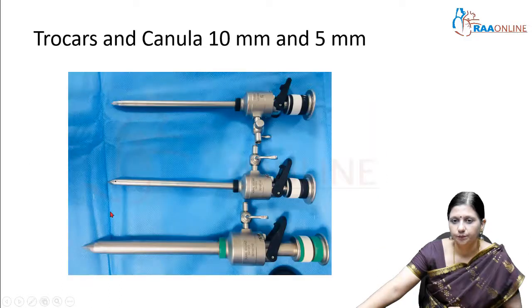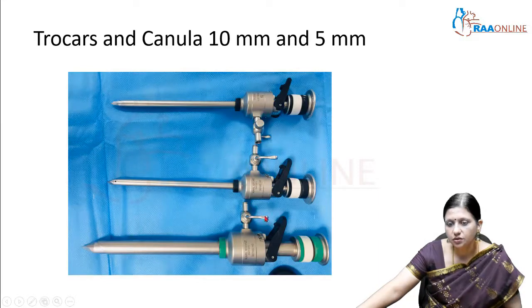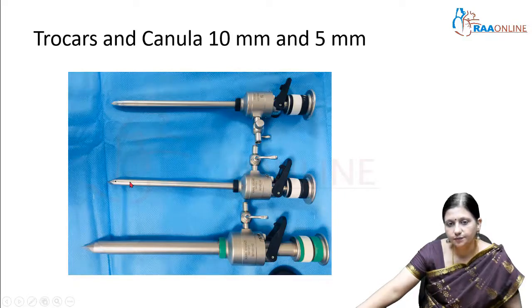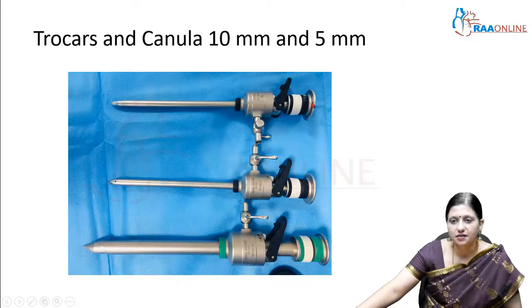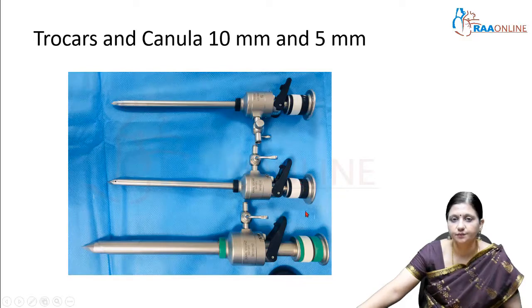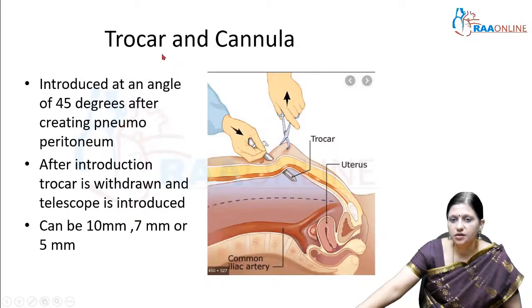These are the trocars and cannulas which are 10mm and 5mm. This is closed here, and if you move it to this side you can attach the insufflation tubing here. This is the cannula with a sharp trocar inside. This is the air inlet. The trocar is removed and then the laparoscope is introduced after removal of the trocar from the cannula.